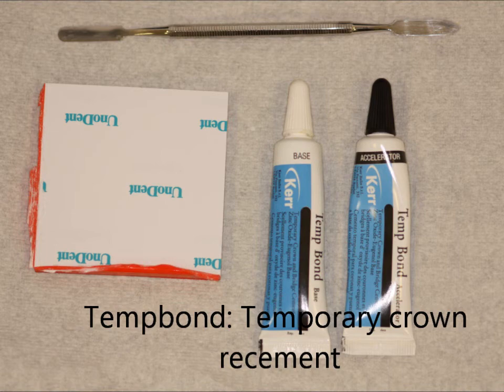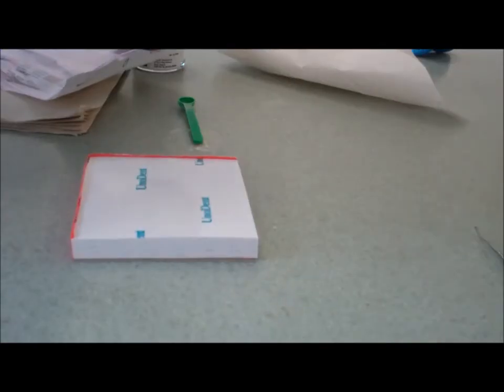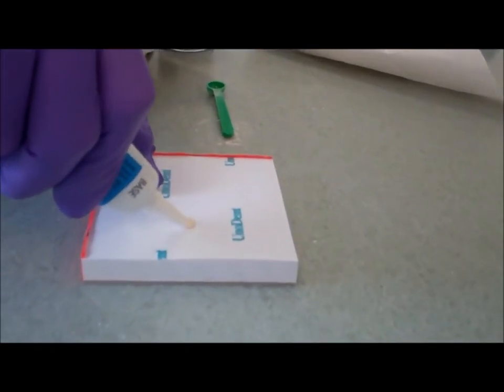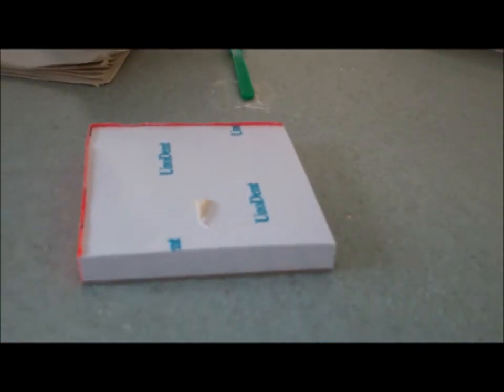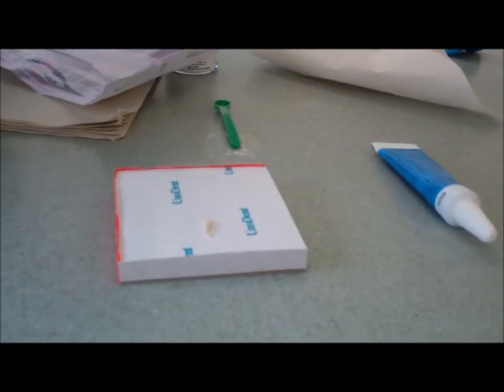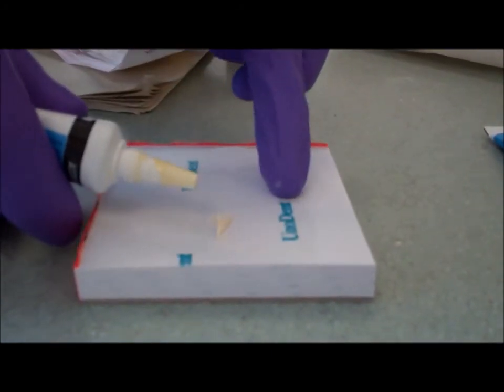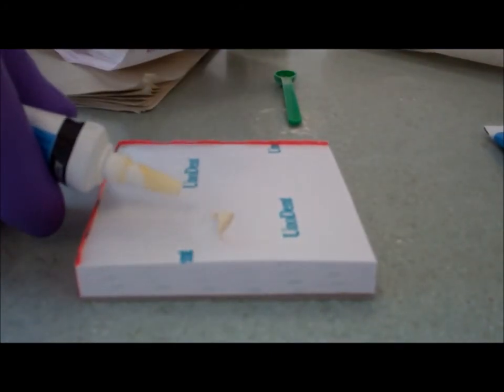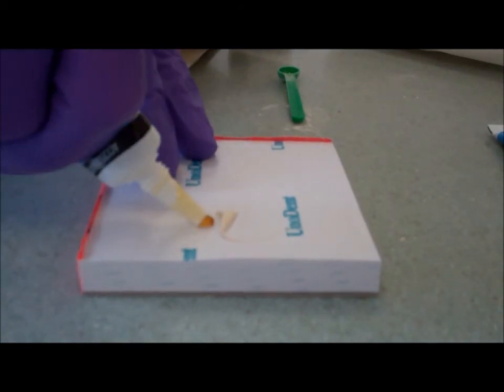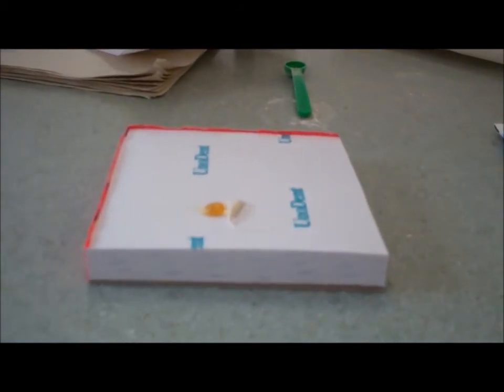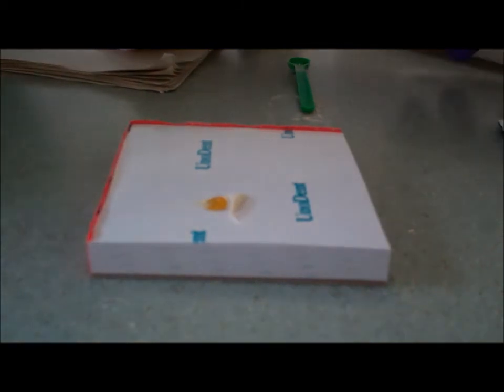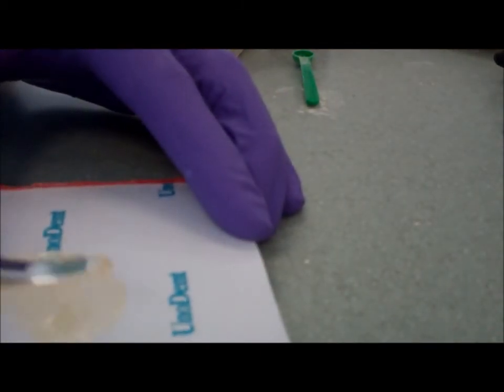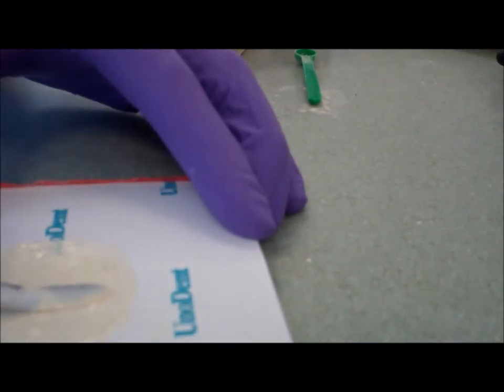Temp bond is a temporary crown re-cement material and it's the only cement we would use to temporarily re-cement crowns. Again it's two liquids, a base and a catalyst. Put equal amounts of each onto the pad. Don't make sure the nozzle of one end doesn't touch the other otherwise you'll get a setting reaction happening in the tube. They are different colors so you're just going to use your spatula to mix them up until they're a uniform even color.